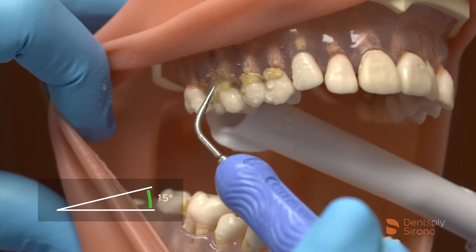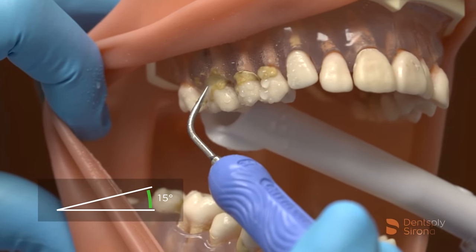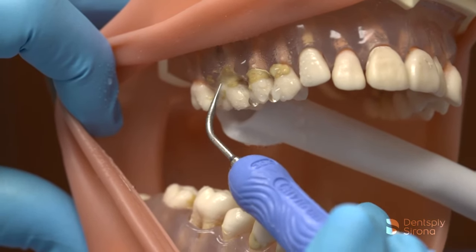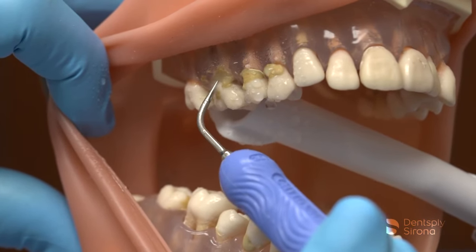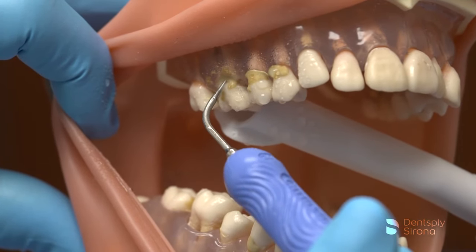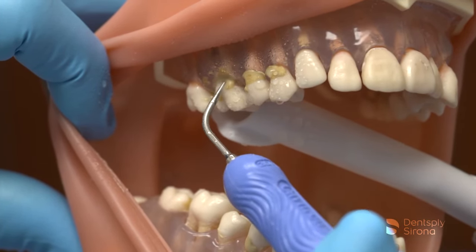When calculus is encountered, tap at the deposit in a multi-directional approach. Micro-fracturing the deposit and following with two to three millimeter sweeping strokes to flush the sulcus disrupts the biofilm and allows the clinician to assess the success of this technique.